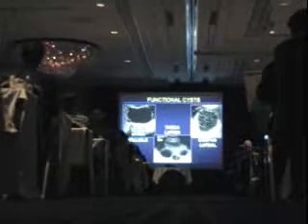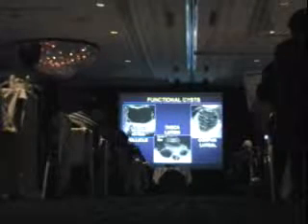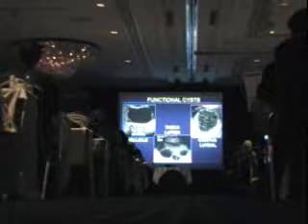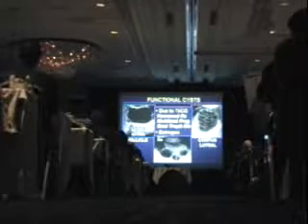In this case, I would call this a third type of functioning cyst, where I see multiple peripheral large follicles. Those are theca lutein cysts in the environment of increased HCG.